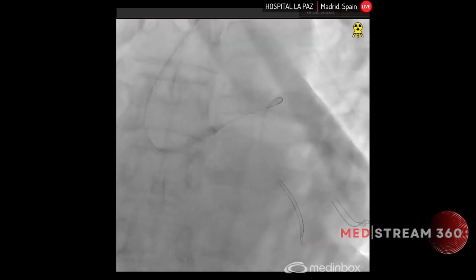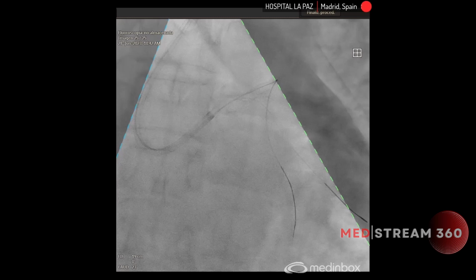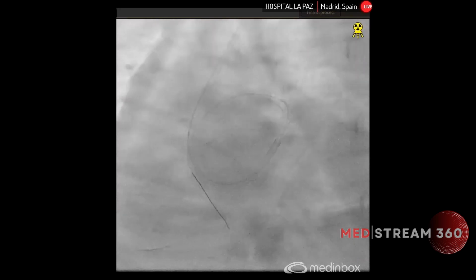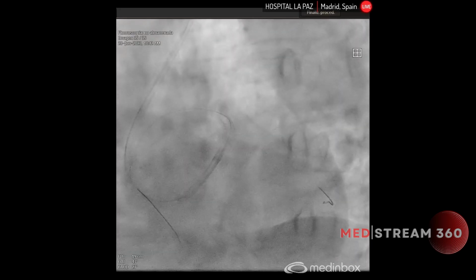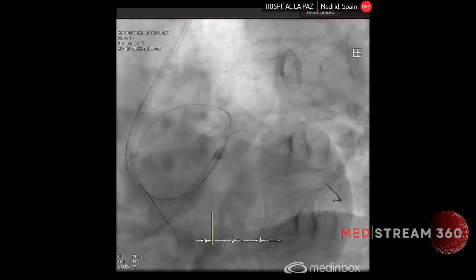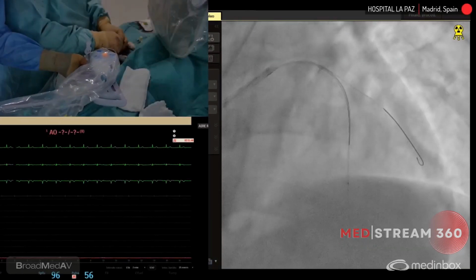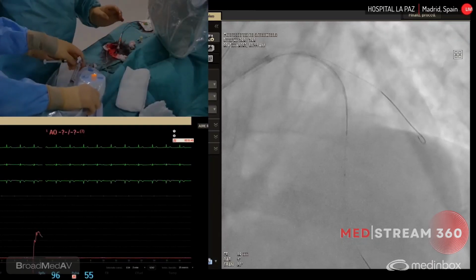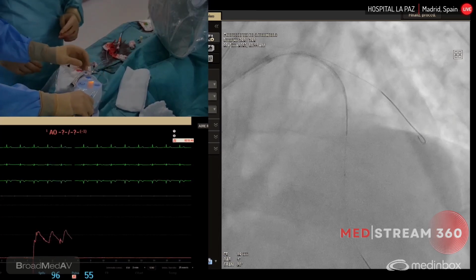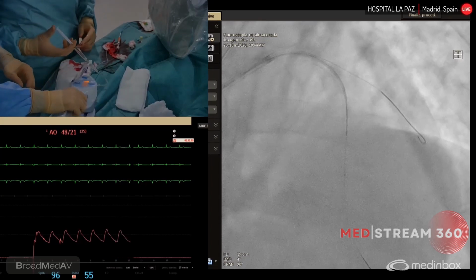Yeah. There is also a funny small intermediate branch that is still alive after the stent. Probably. And we can do IVUS. That's our plan. IVUS, please. Check it, and we can interrogate also the result of the stent in the left main proximal LAD, and even the distal landing of the stent, and probably the need to treat the distal plaque near the diagonal.